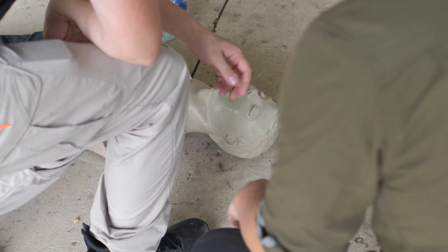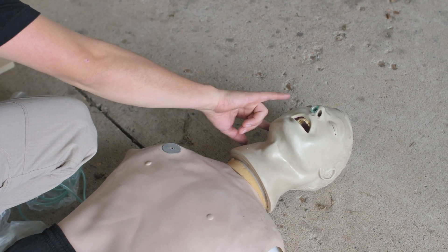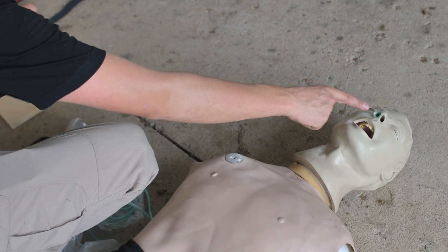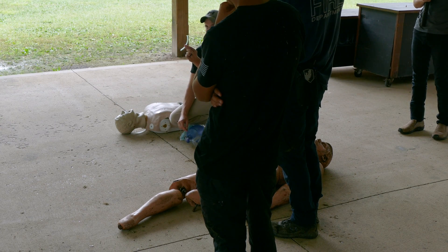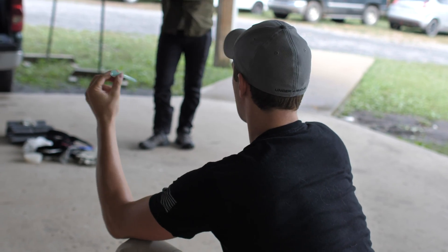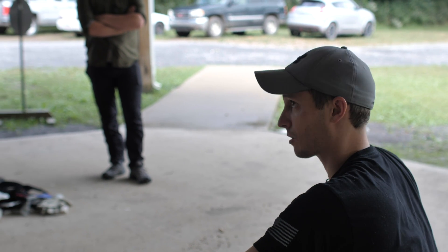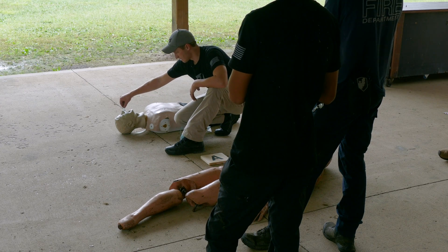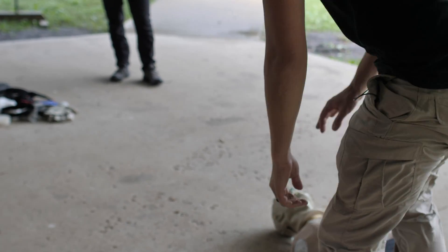When measuring NPA size, go from the earlobe to the corner of the nose — that's about the same distance as where the back of the tongue would be. Use that as an external landmark. Typically the most common size is a 28 — you're not going to stock six different sizes in your first aid kit. The military uses all 28s on their IFAKs. If you want to be proactive, size it to yourself and stick that in your IFAK. Slide it in, wiggle back and forth, use a little lube or saliva if needed, and slide it into place.